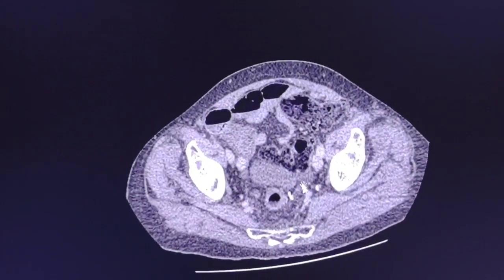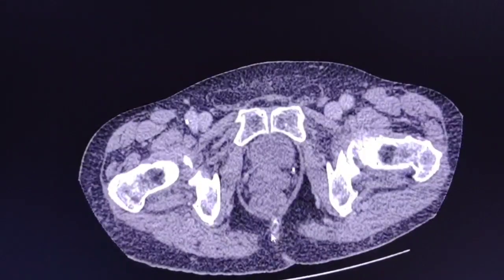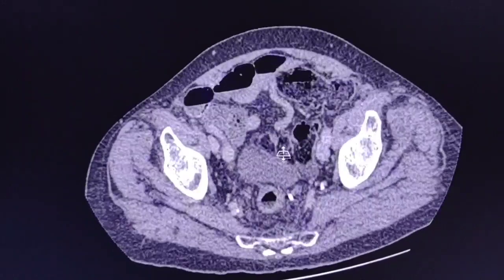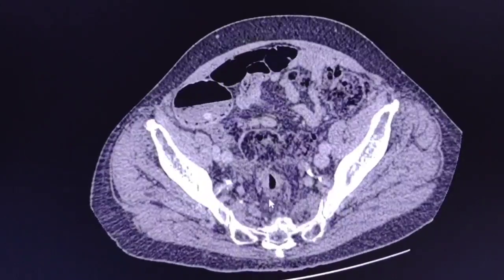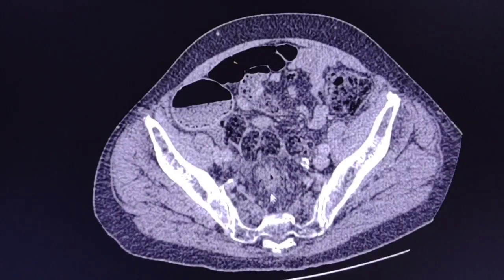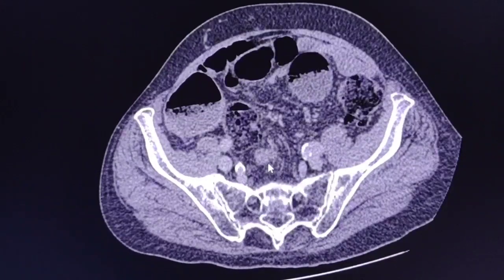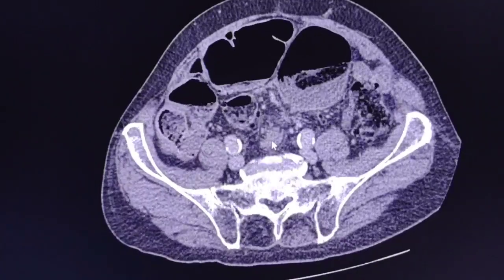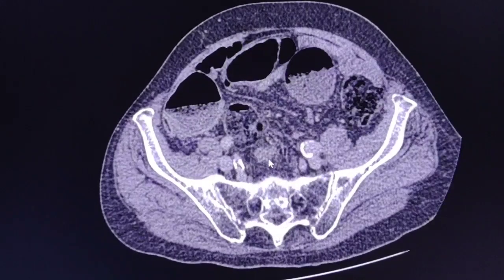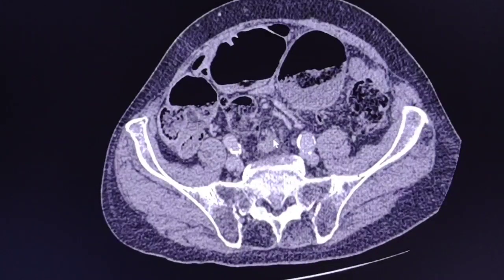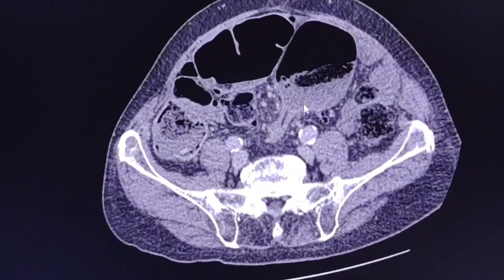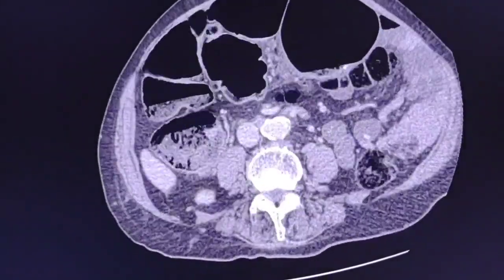We start from the anorectal region and track up the large bowel. You can see that the large bowel is collapsed at this point, and then we can see a significant dilatation of the sigmoid colon.